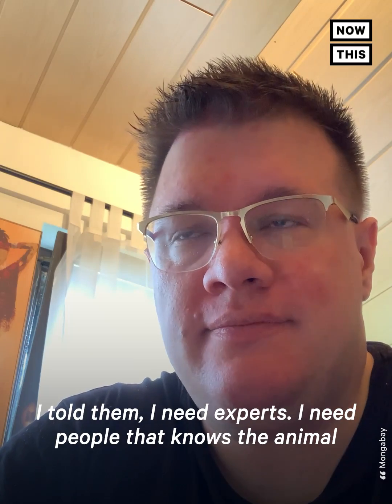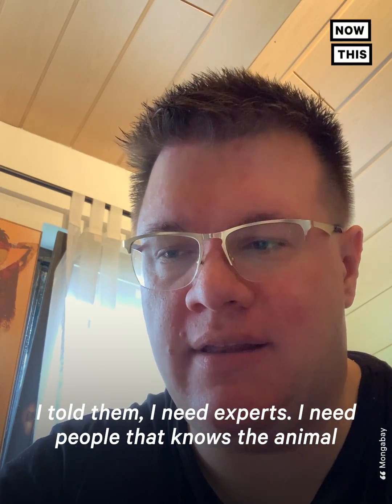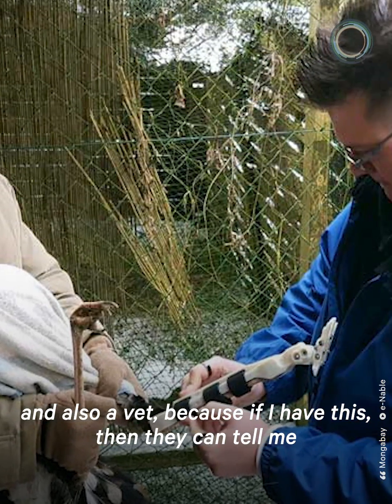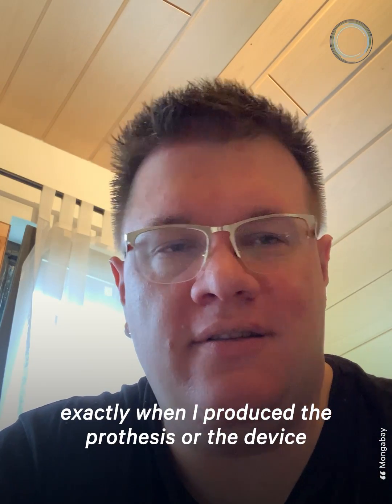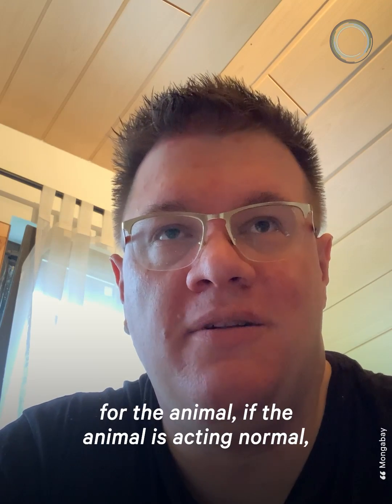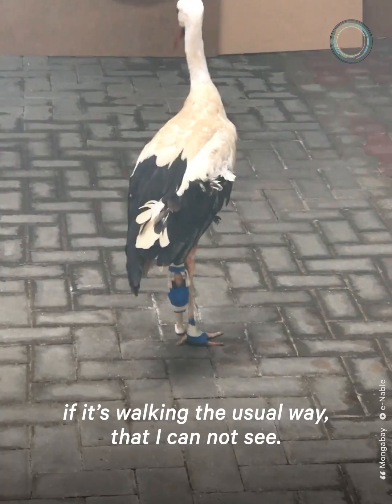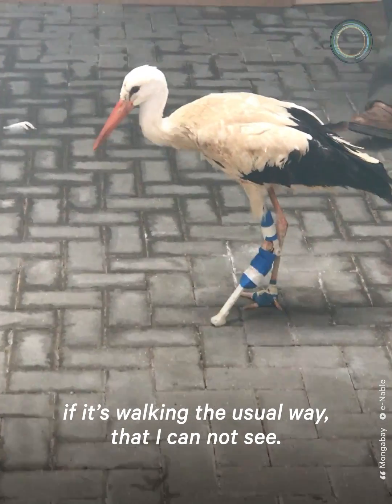I told them I need experts — I need people that know the animal, and also a vet — because they can tell me exactly, when I produce the prosthesis or the device for the animal, if the animal is acting normal and if it's walking the usual way that I cannot see.